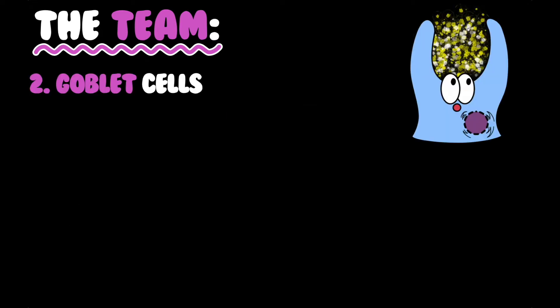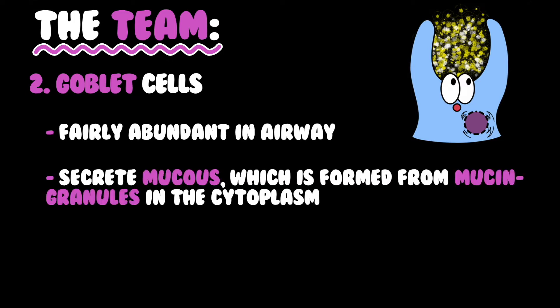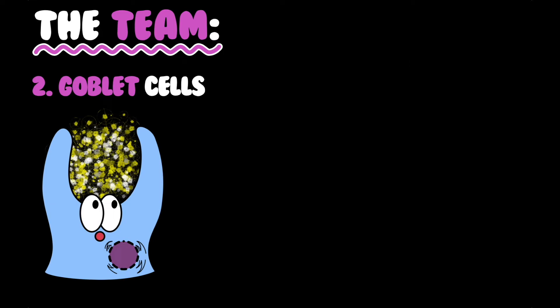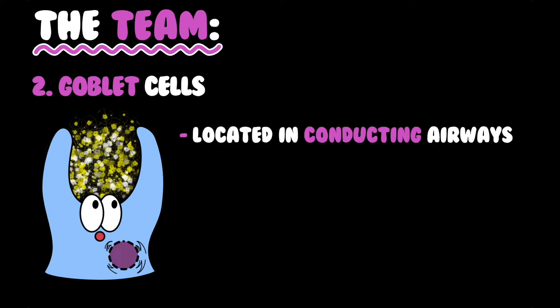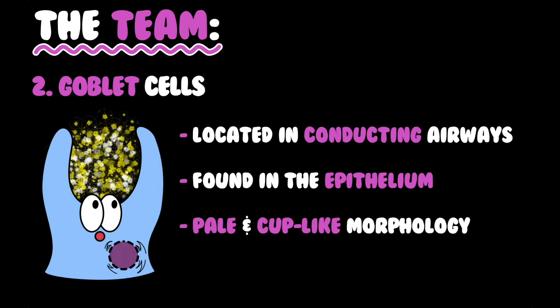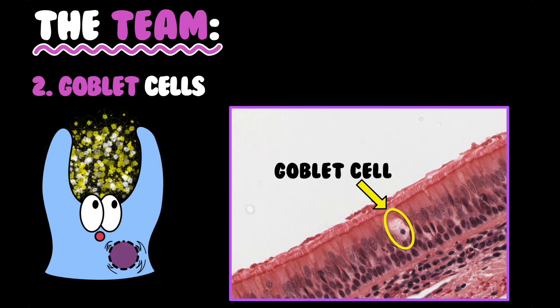Goblet cells are fairly abundant in the airway. They secrete mucus which is formed from mucin granules in the cytoplasm, and the mucus traps particulates and microbes. Goblet cells are located in the conducting airways, found in the epithelium, and are pale and cup-like in morphology. This is our epithelium, and this is a single goblet cell.